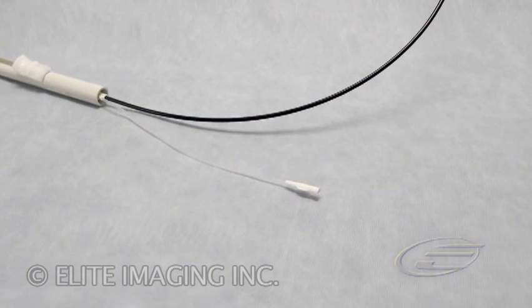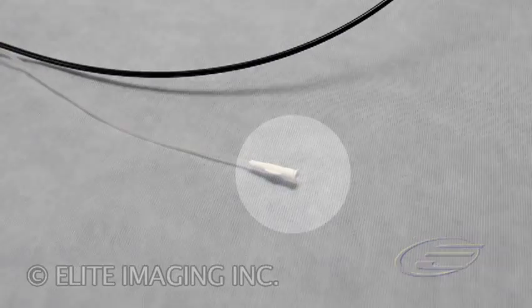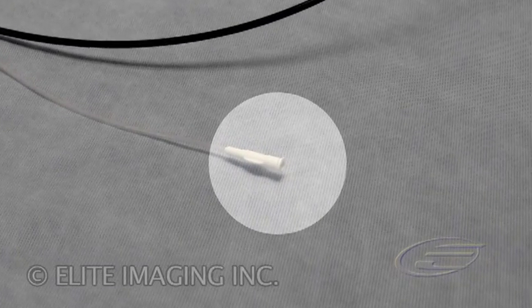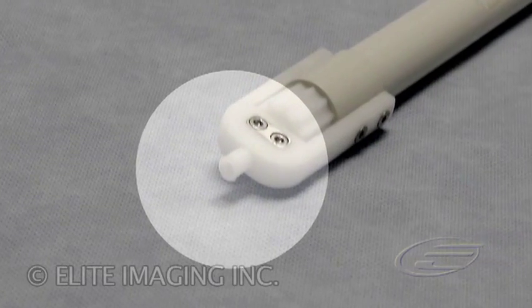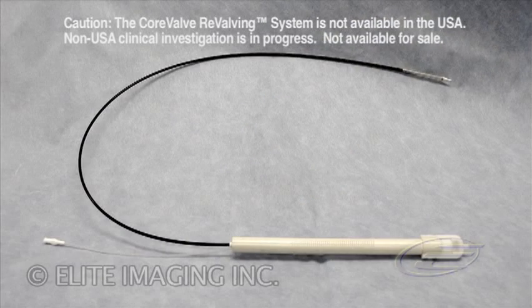Attach a 10 milliliter syringe filled with sterile saline to the T-connector on the handpiece and flush. Flush the guide wire lumen on the catheter. The CoreValve ReValving system is now ready to be used.